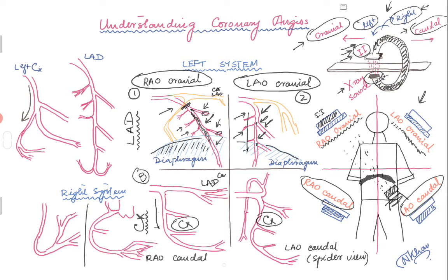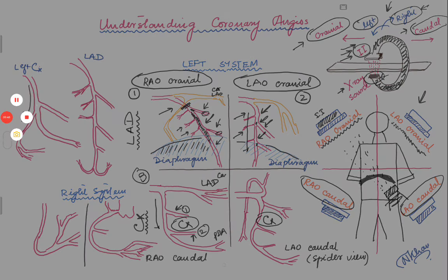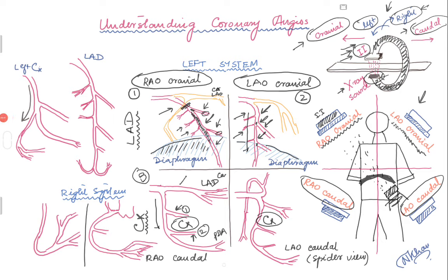Now the caudal views — image 3, the RAO caudal view. The left circumflex comes down with OM1 and OM2 branches visible. In a dominant system, the PDA and PLV may also be seen. The RAO caudal view is good for looking at the body of the left circumflex, the proximal LAD, and the OM branches. It is the view of choice for ostial disease or disease in the body of the left circumflex.